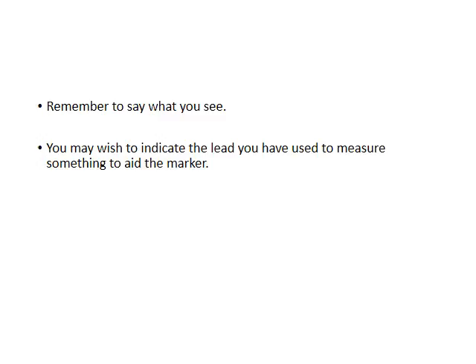Next, we are going to look at the components of the ECG complex. In your ECG analysis, say what you see. Sometimes descriptive words are appropriate, rather than trying to write a technical word. When writing commentary, and particularly taking measurements, state which lead you are referring to.